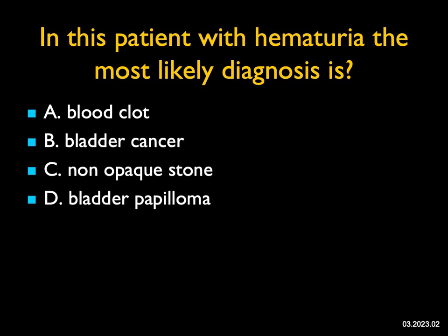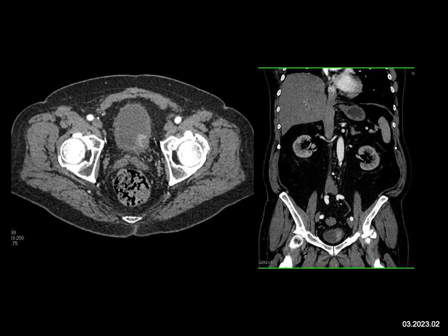In this patient with hematuria, the most likely diagnosis — looking at the axial and coronal views — there's a mass at about five o'clock near the left UV junction. It's enhancing. If something's enhancing in the bladder, it's a bladder cancer. It's a TCC until proven otherwise. We pick up lots of incidental bladder cancers, particularly with arterial phase imaging. We give water to distend the bladder and give IV contrast, and although bladder cancer isn't thought of as hypervascular, it enhances to 70 to 90 Hounsfield units, and against urine at 0 to 10, it stands out very nicely.